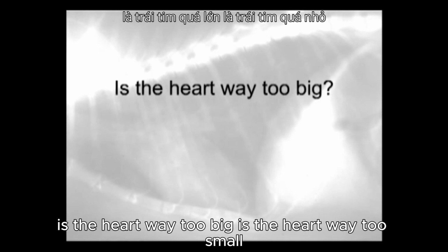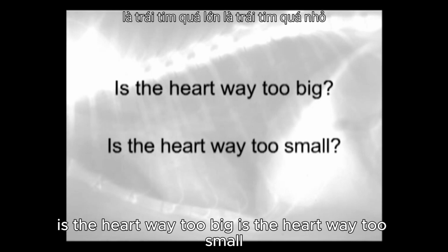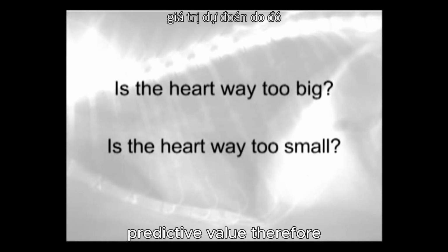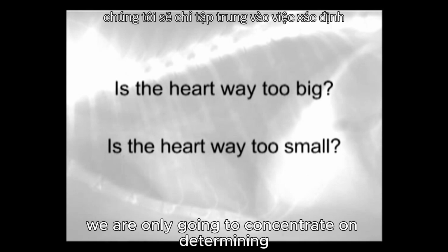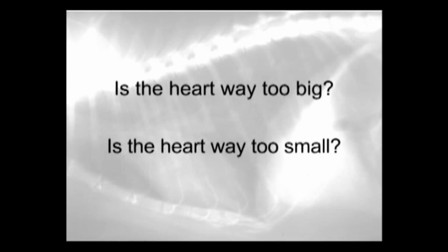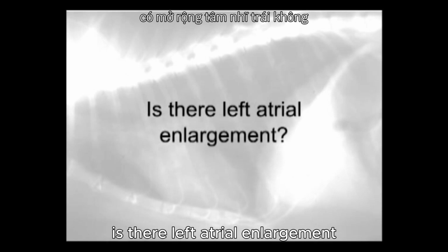Is the heart way too big? Is the heart way too small? Remember that subtle changes in heart size do not carry a high predictive value. Therefore, we are only going to concentrate on determining if the heart is way too large or way too small. Is there left atrial enlargement?